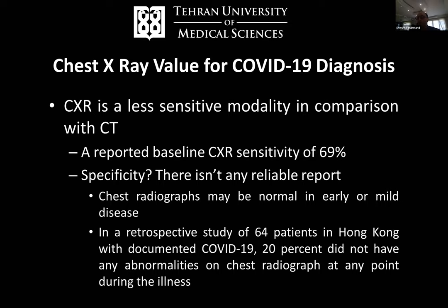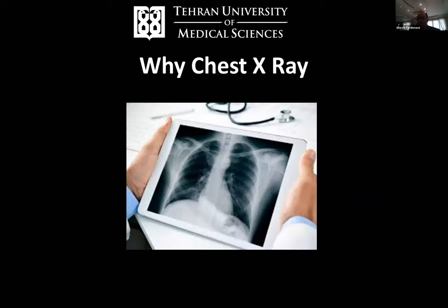According to a study which was conducted in Hong Kong among patients with documented and confirmed COVID disease, exactly 20% didn't have any abnormalities on chest radiograph at any point during the course of the disease. And this is very important: chest X-ray is not sensitive and not specific for diagnosing COVID. But why do we use chest X-ray?